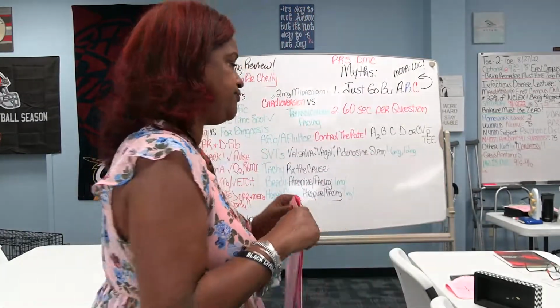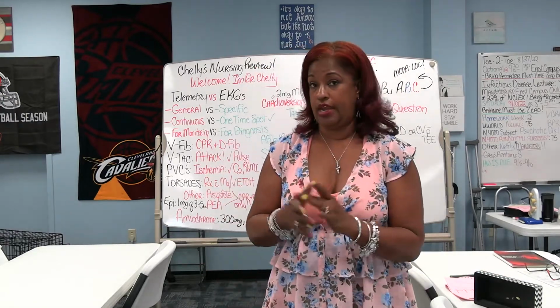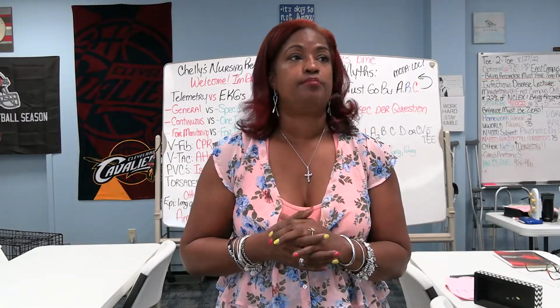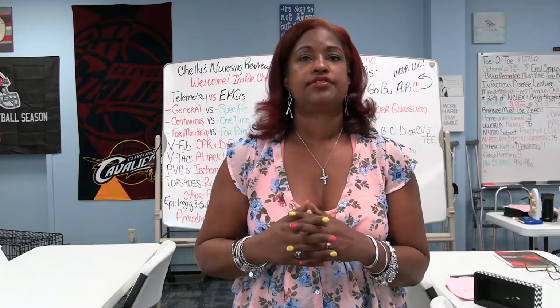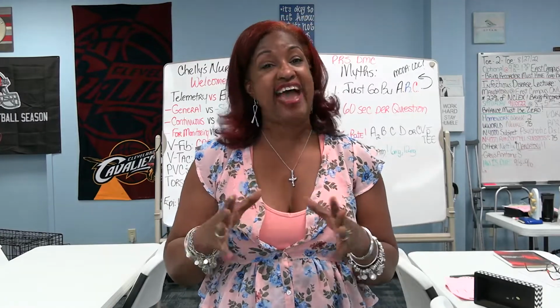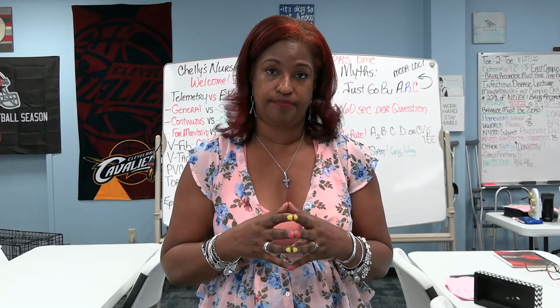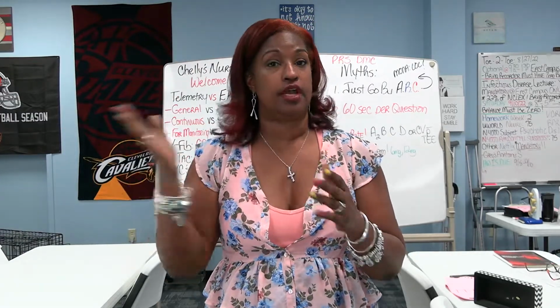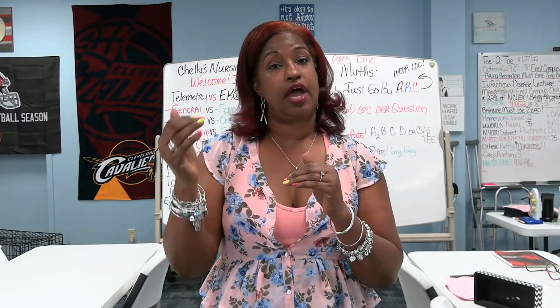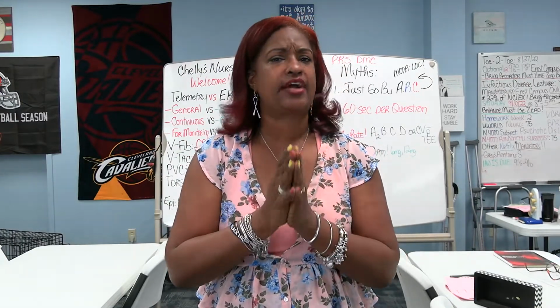Now, let's go a little bit further into talking about rates, right? You and I both know that a heart rate less than 50 to 60s is a bradycardia. Most of us would say under 60. Some would not worry too much in the 50s, but I need you to know definitions. So a heart rate technically less than 60 is going to be considered a bradycardia. A heart rate greater than 100, and in my day, because I'm old, I graduated in the 80s, we used to say a heart rate greater than 90s. But now the definition is a heart rate greater than 100 is tachycardia.